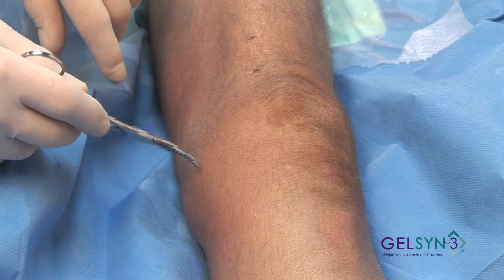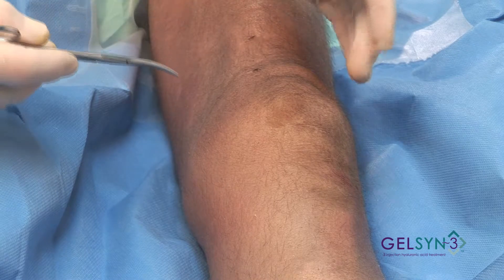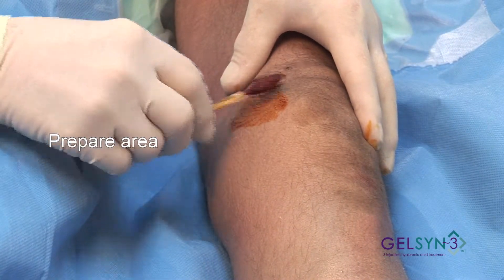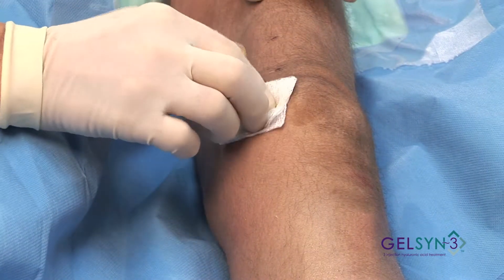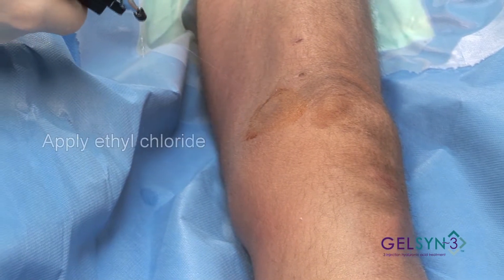You want to be careful. That's one of the reasons that I prefer the lateral approach. Now we're going to paint the area with our iodine, remove the excess, and use our ethyl chloride.